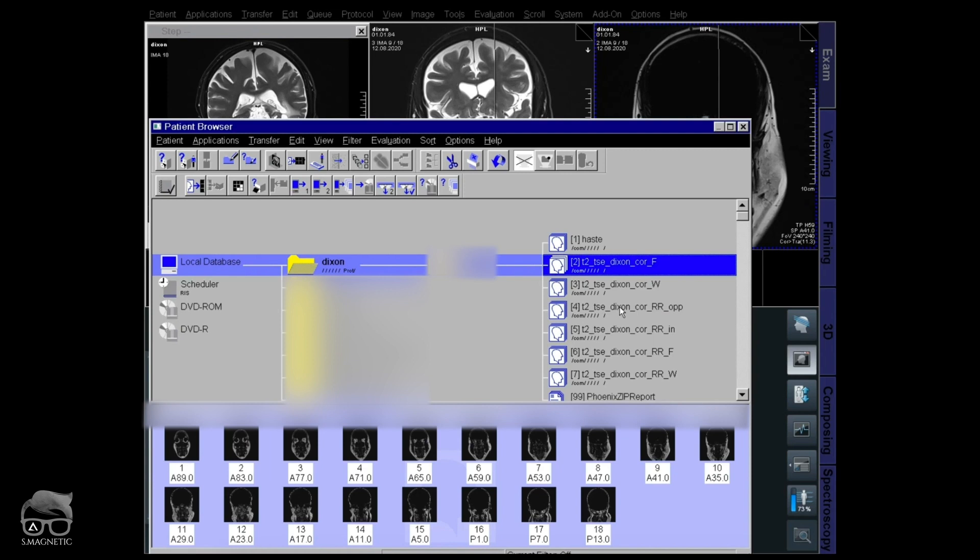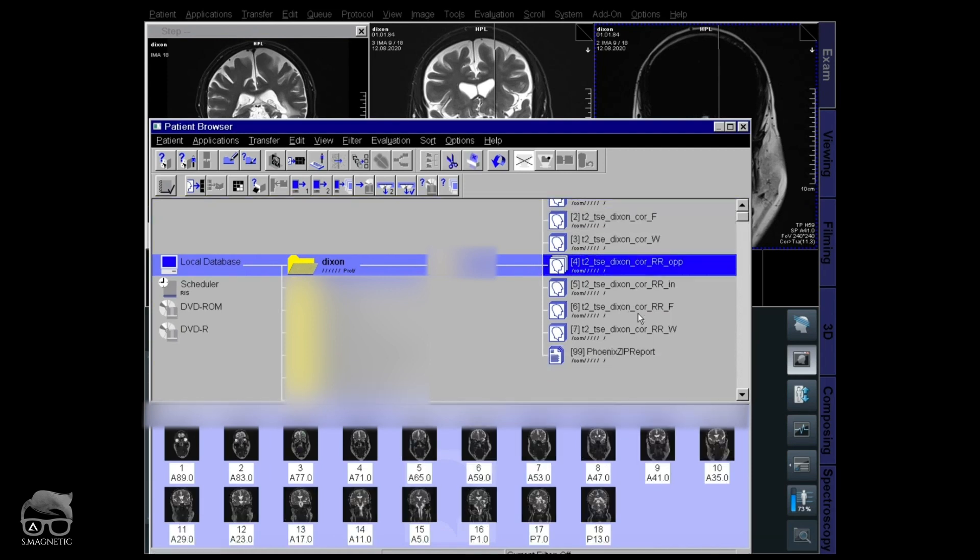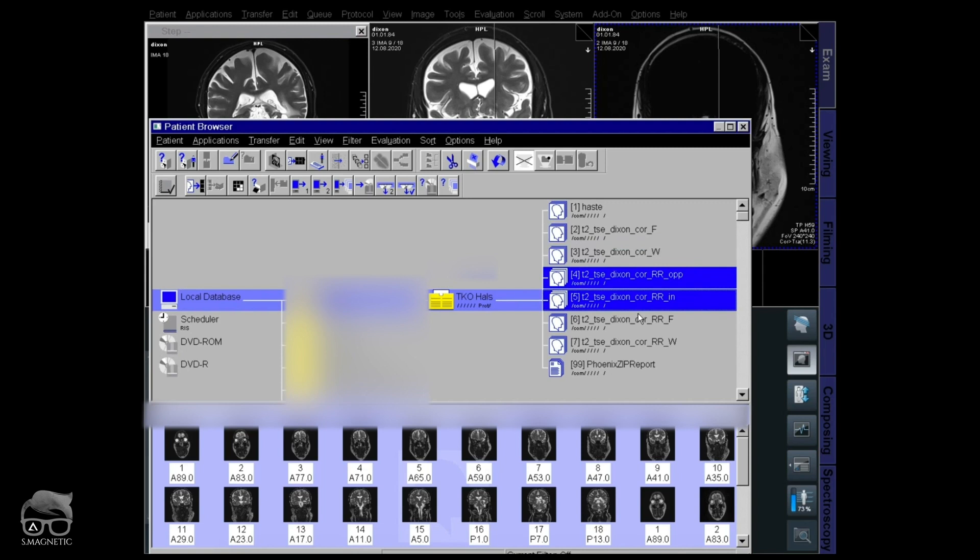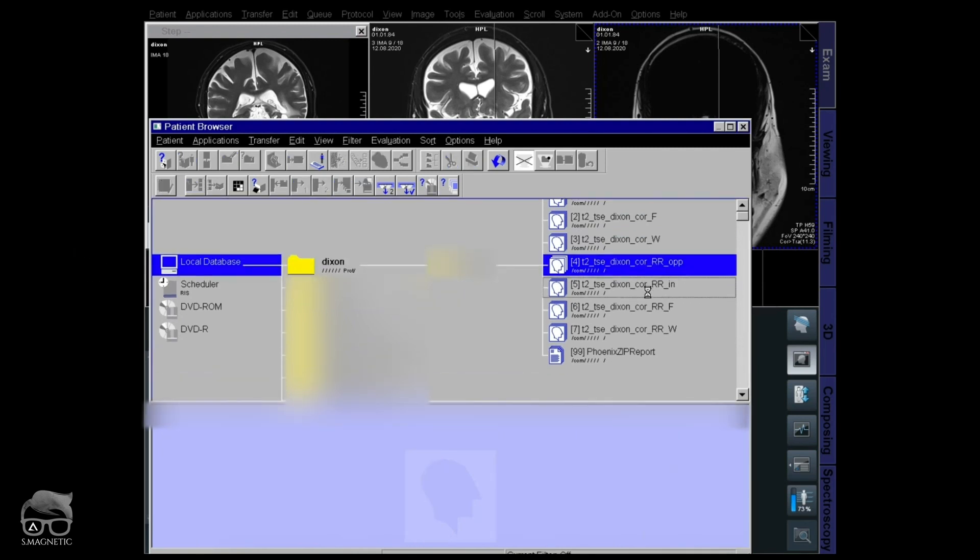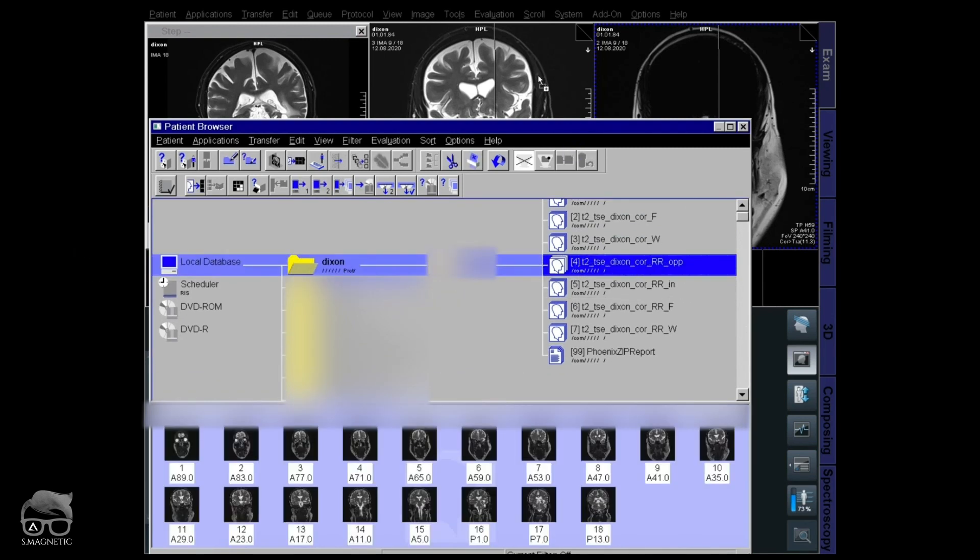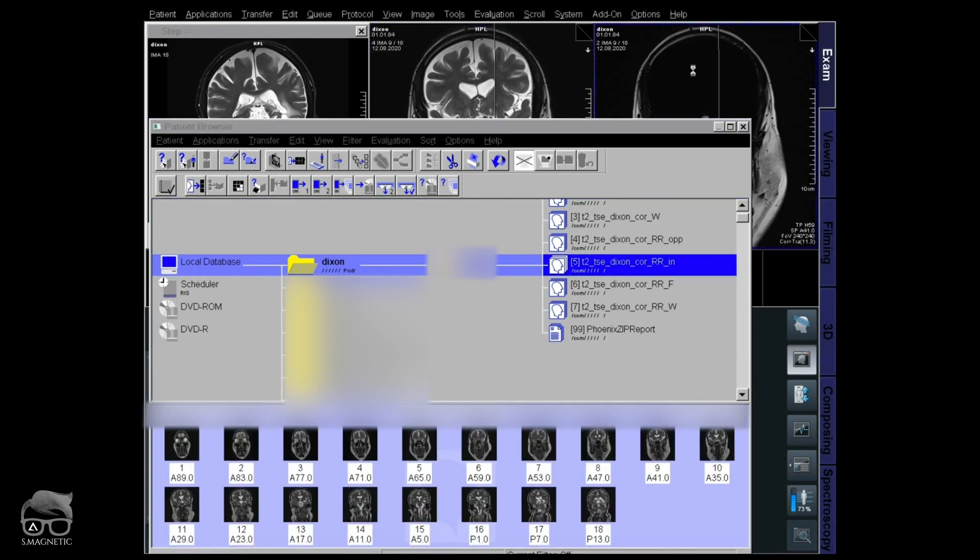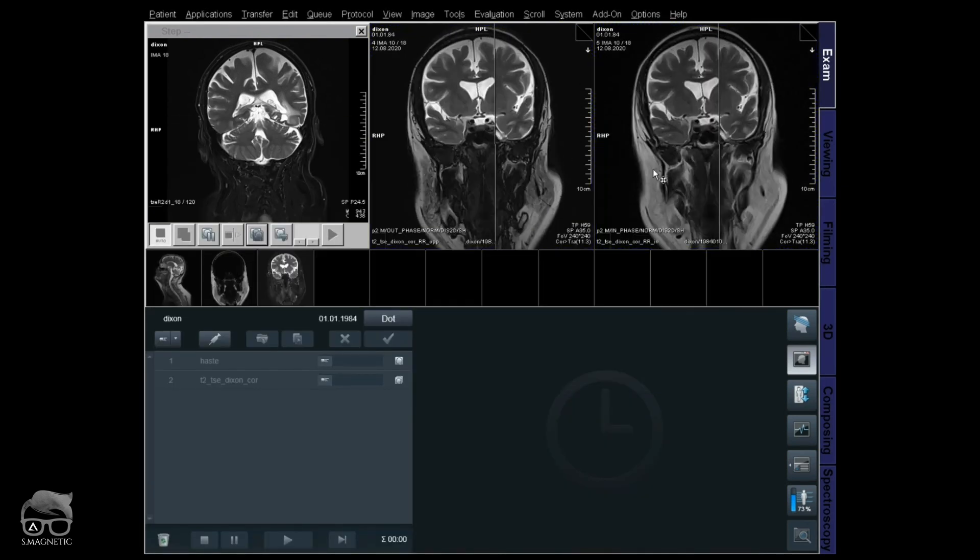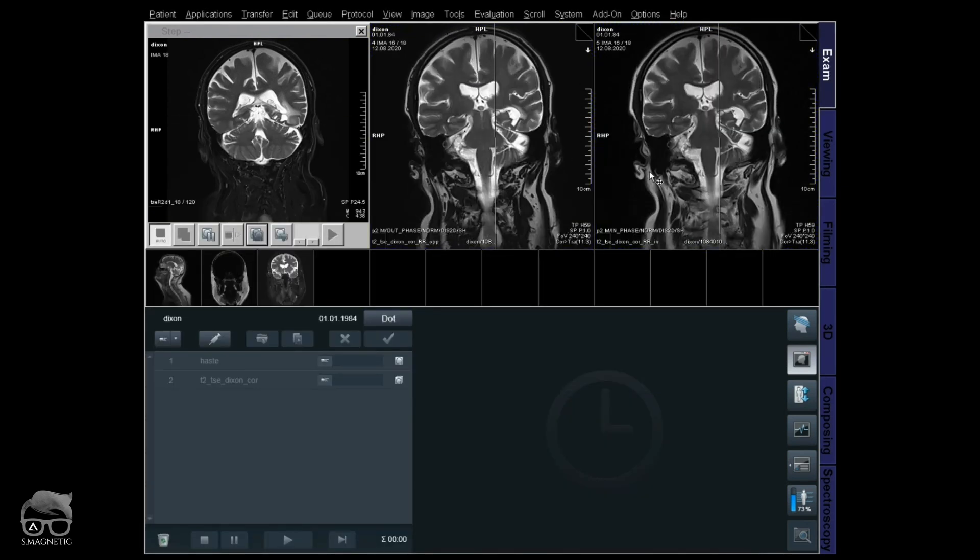So in here now you have all four images: the opposite and in phase. Let's check those images. This is retrospective reconstruction, RR. Opposite and then in phase. There you have it. You have it all.